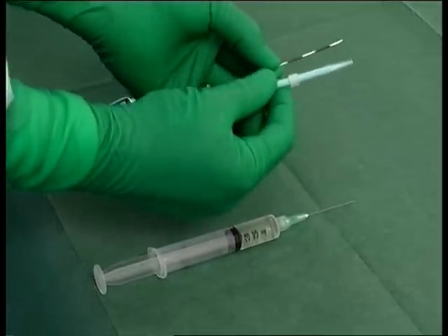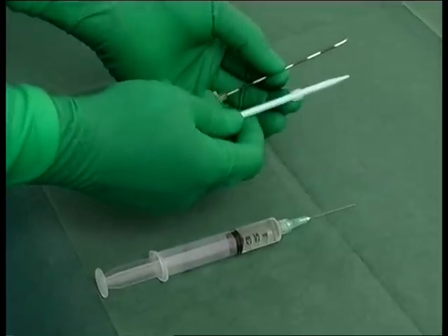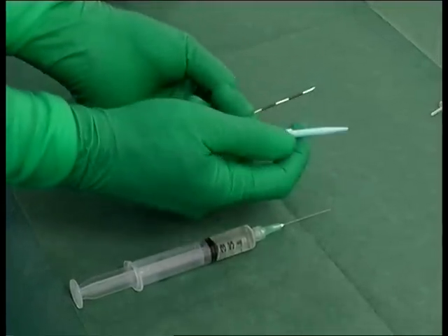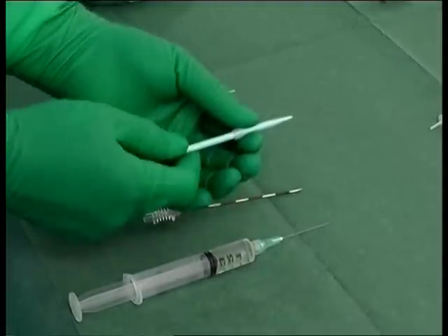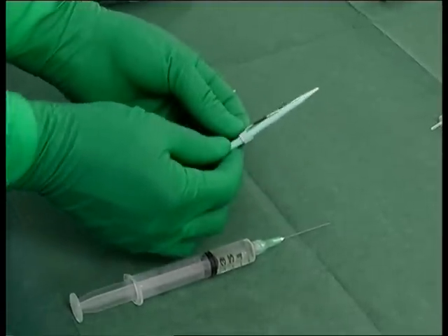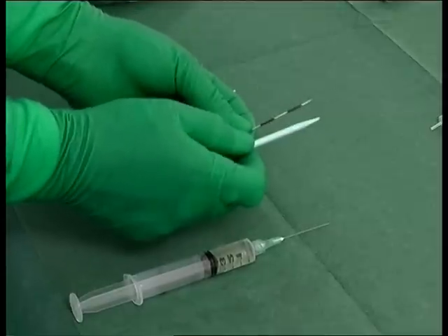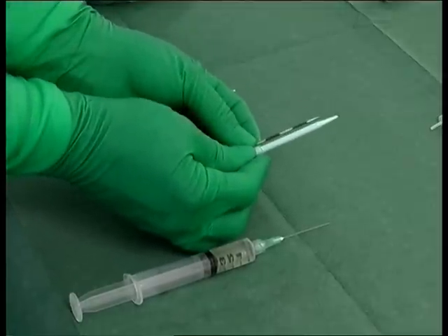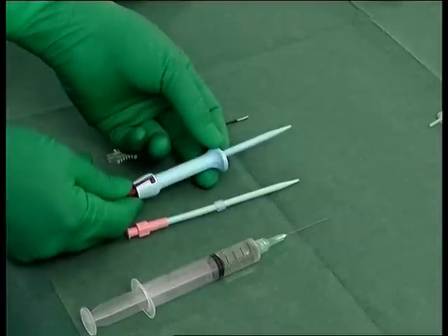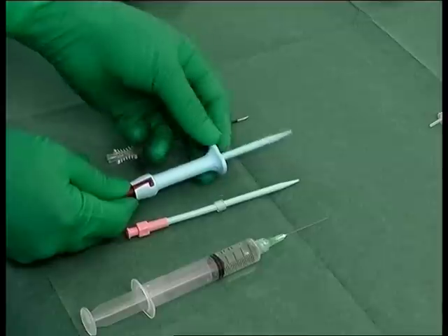The dilator is supplied with a safety stop set at 3.5 centimetres. This stop should be adjusted to the chest wall thickness, with 1.5 centimetres added to ensure the full diameter of the dilator passes through the parietal pleura. The latest dilator now has a removable guard set at 5 centimetres from the tip.